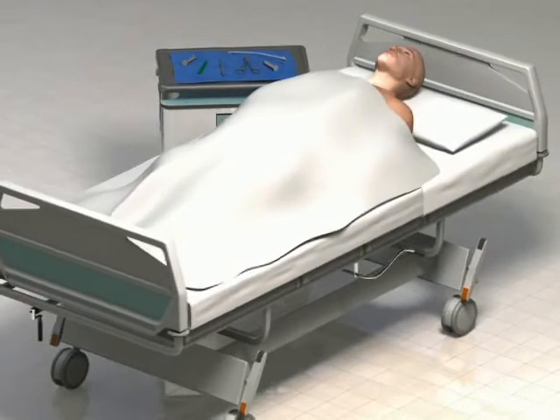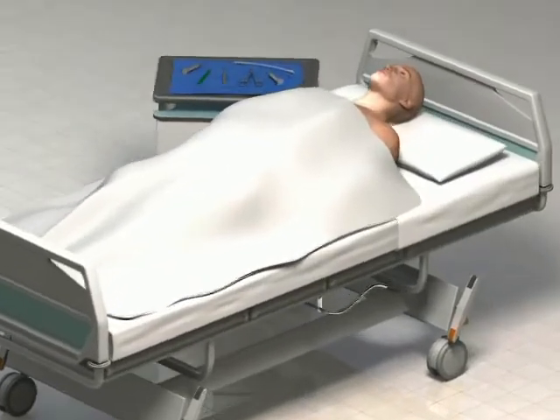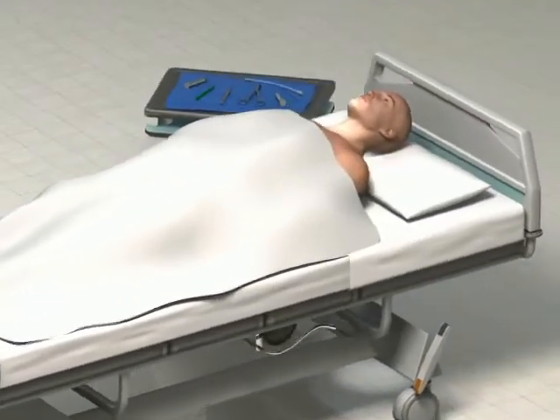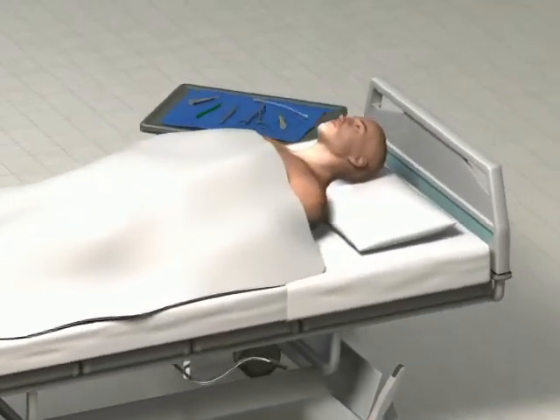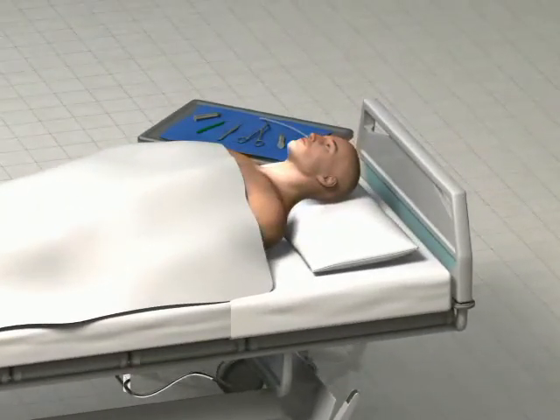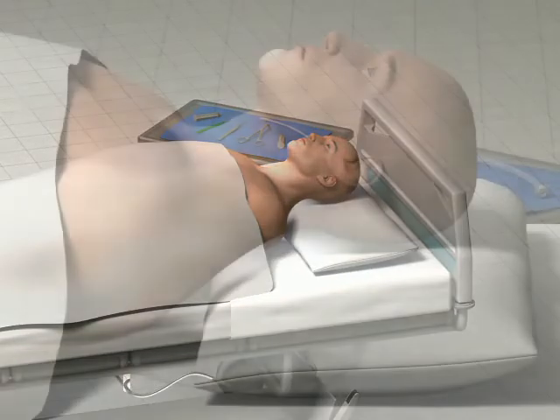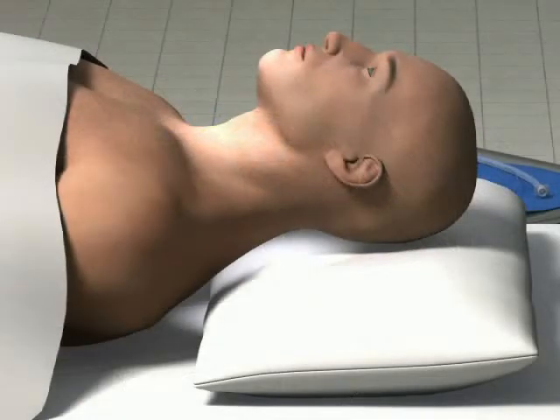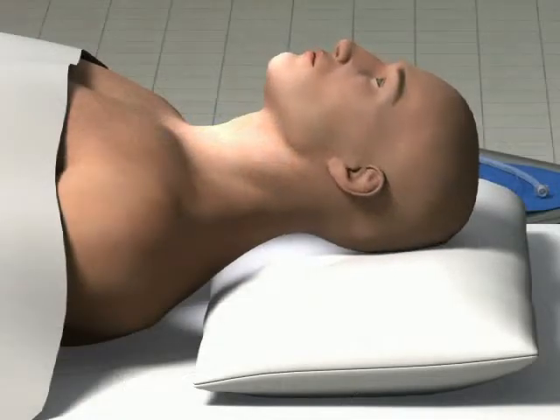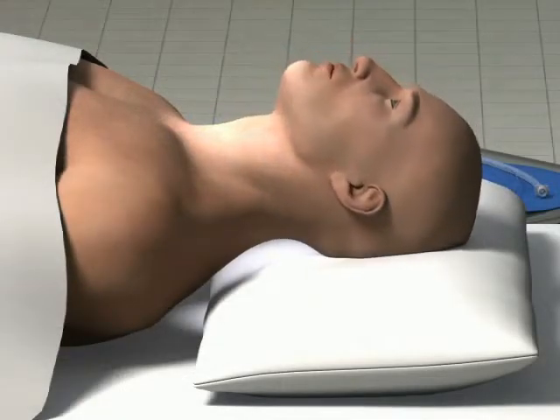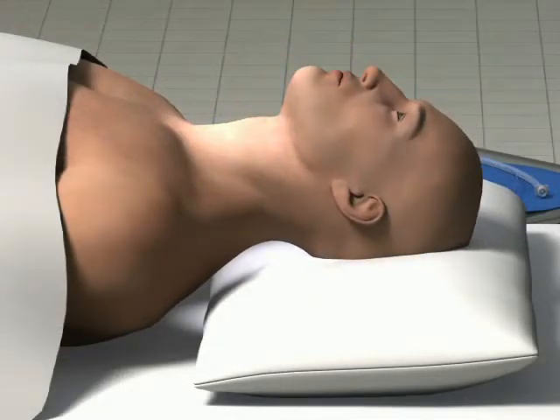Preparation for both the traditional surgical cricothyroidotomy and the Melker technique is the same. Position the patient supine on the stretcher. Hyper-extend the neck to better expose the anatomic landmarks, provided that cervical spine injury is not a concern.